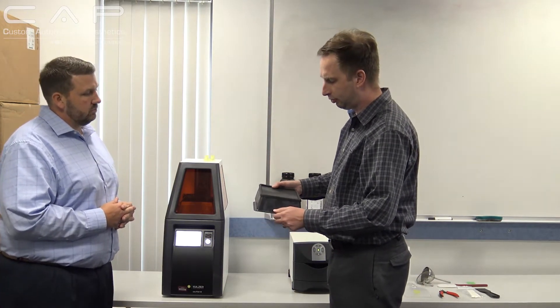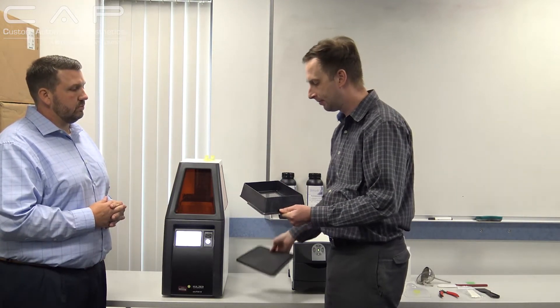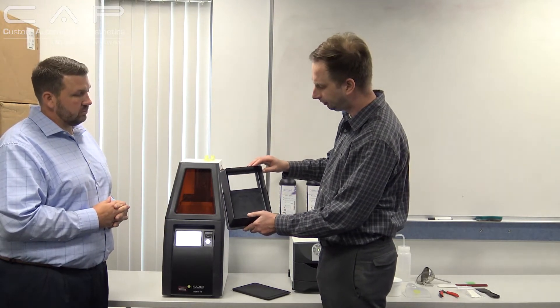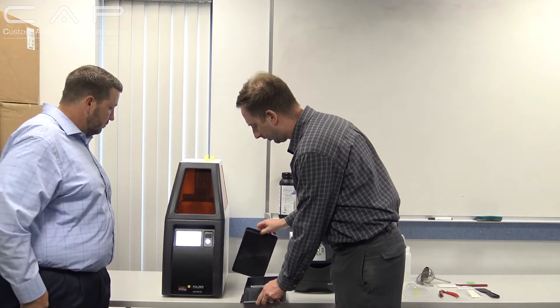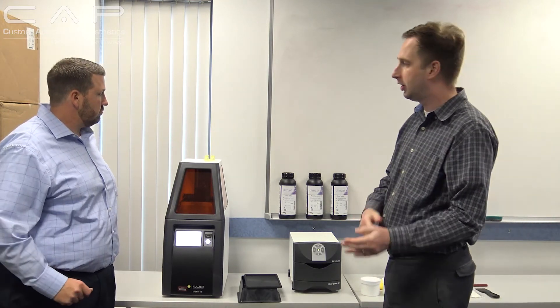The last thing I'd like to show is the tank and the build plate. If you want to store extra material on the side, you can pour in the material while it's printing. This is approximately the build plate size — it's actually a pretty nice, versatile size. They came here today and showed us all of this on the printer, and it's just been really, really impressive. This is the full kit — a really, really nice system. Thank you so much for coming, Andy. Thanks for having us. We appreciate the time. Have a great day.